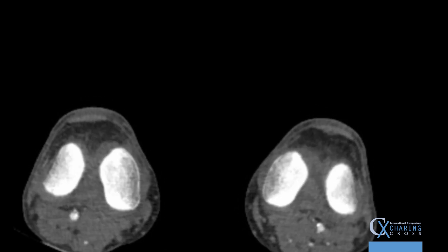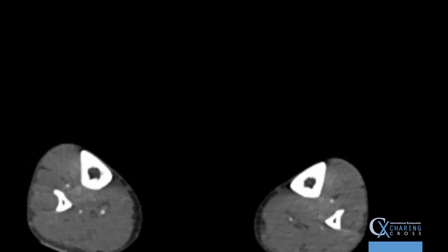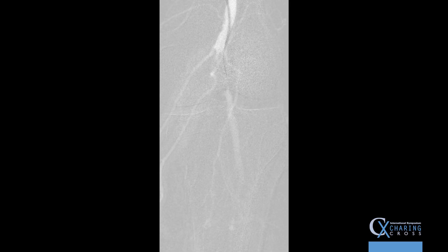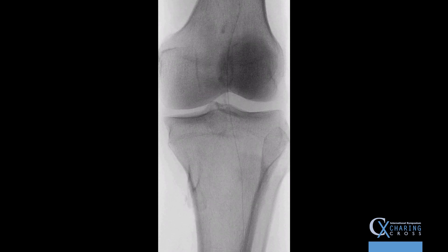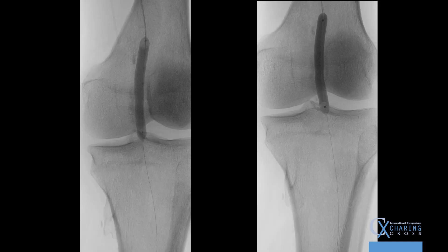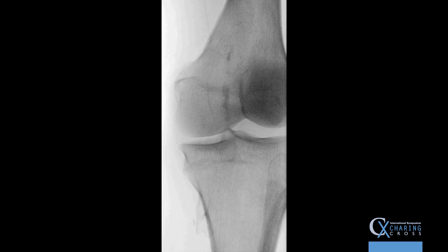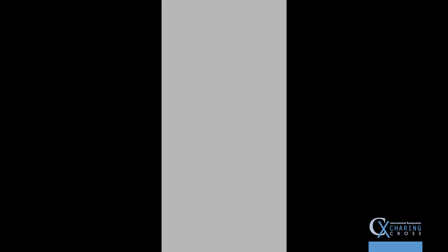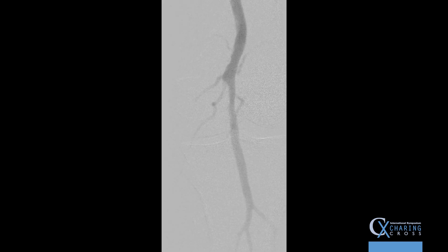Based on the pre-operative CT scan, we take the patient to the angio suite and perform an angiogram where you see this lesion that is nearly an occlusion of the popliteal artery. After crossing, the lesion is prepared with a 6.5mm shockwave balloon based on pre-operative sizing. After good preparation, a drug-coated balloon (DCB) is used for three minutes to avoid restenosis. Here is the final angiogram showing a really nice result. The patient was discharged the same day, and after one month he is healthy with no more disabling claudication. The duplex shows very nice results with no more significant stenosis at this level.